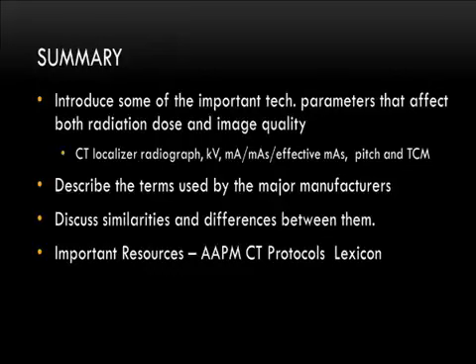I have a question about the reference mAs for Siemens. Based on a 70 kg patient, is the scanner measuring what would be the attenuation? And based on that, this should be the right mAs, say, for example, 250. Is that right?